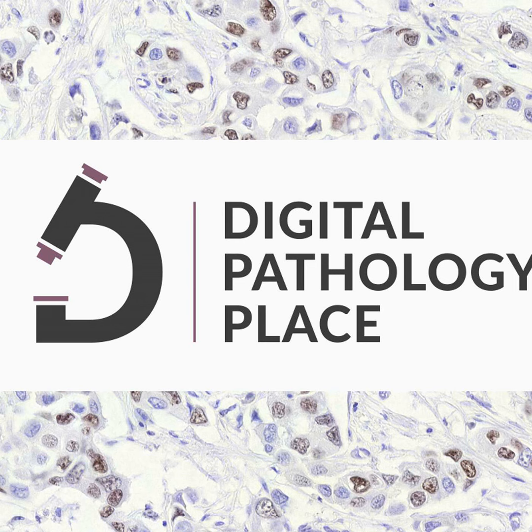So, for one, there's great open source tools out there, right? QuPath, for example, is one we've used quite extensively, and QuPath, with the right sorts of scripting added in, can handle a lot of things. It can handle multiplex data. You can do single cell segmentation. You can extract a bunch of features from those images and then use those for any of the downstream analytical processing you want.